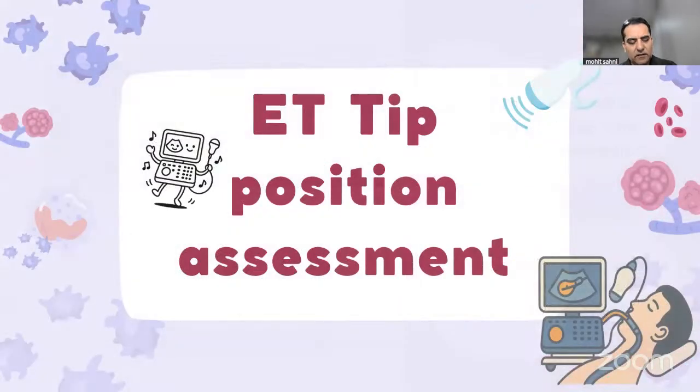So this was just to show you that when we do an echo, we don't concentrate only on the chambers of the heart or only the heart. We have to look around the heart.